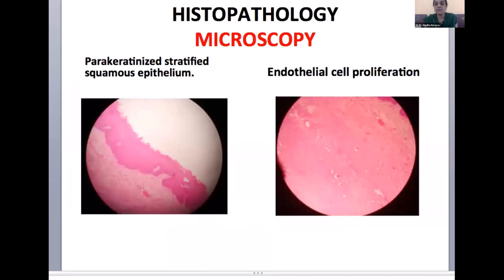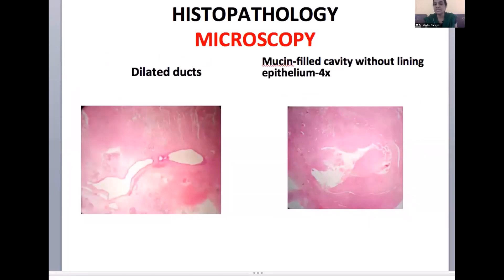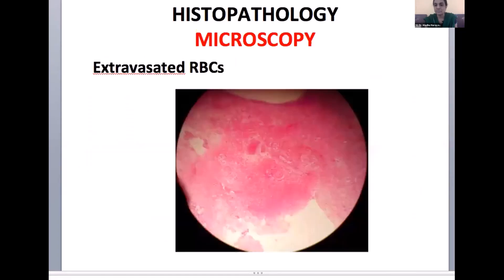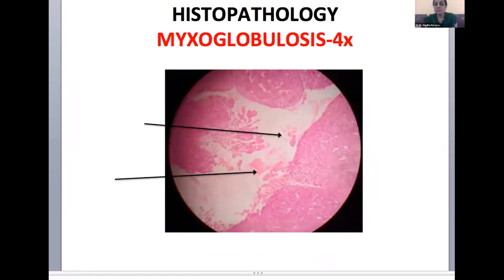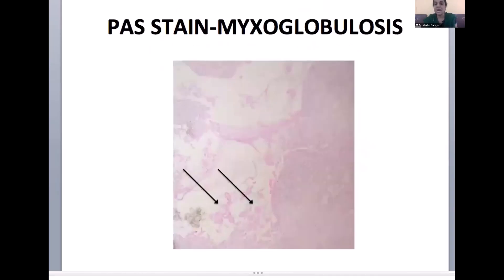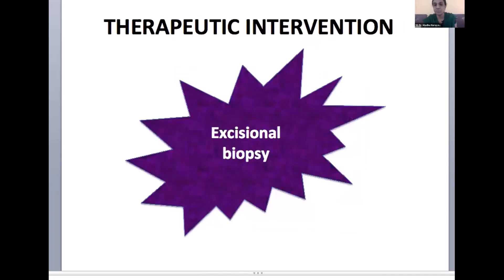The microscopic examination revealed parakeratinized stratified squamous epithelium, and the connective tissue revealed endothelial cell proliferation, numerous dilated ducts, mucin-filled cavity without lining epithelium, acini with septae, numerous blood vessels and plasma cells, along with extravasated RBCs. One more unique feature was noted — the very reason I'm discussing this case — that of myxoglobulosis. Organized collection of mucins showing a laminated concentric pattern was evident in my lesion. A PAS stain was done to elicit this mucinosis, and it was very much positive.